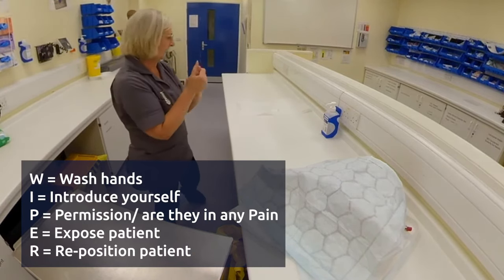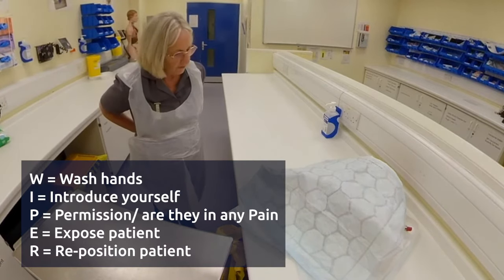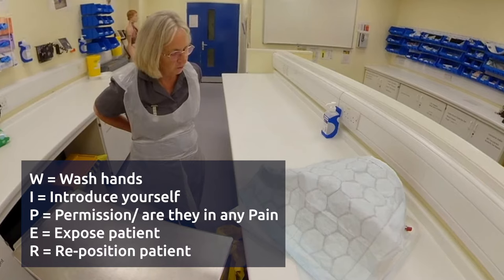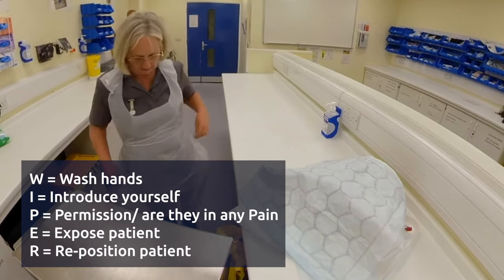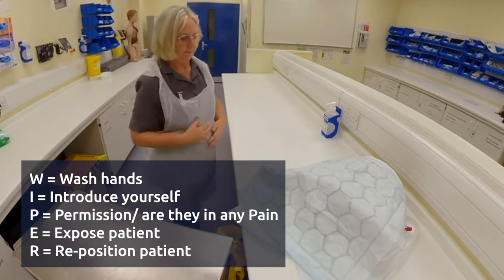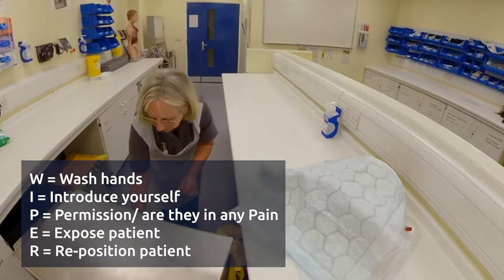I'm just going to gel my hands and pop my apron on. So having a catheter is just a small tube which is going to go into your bladder. It should help relieve some of those symptoms. And then I'm just going to open up my dressing pack.